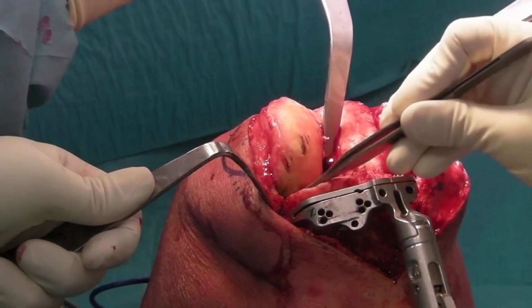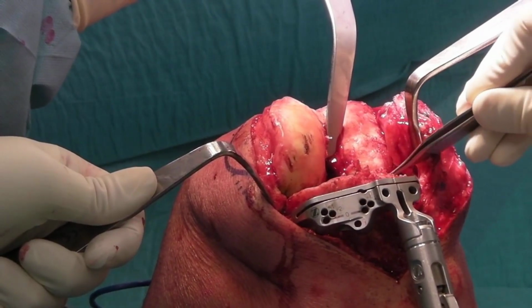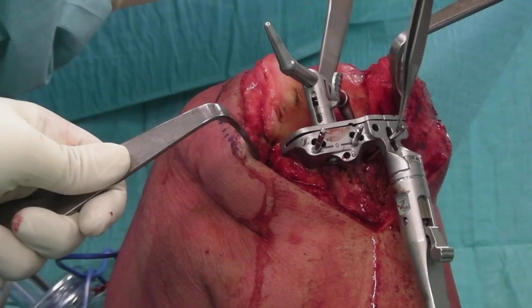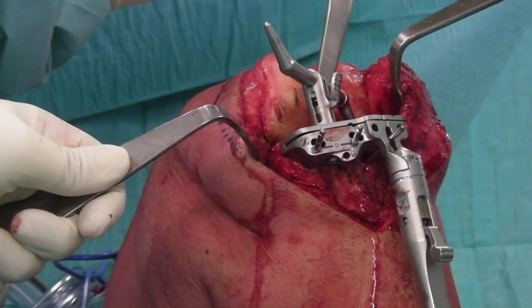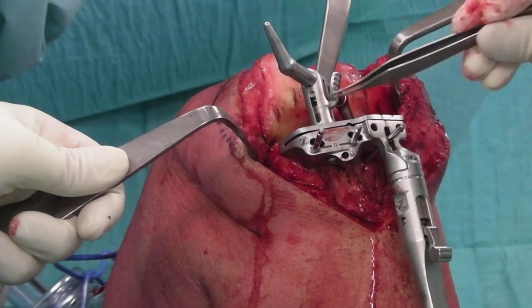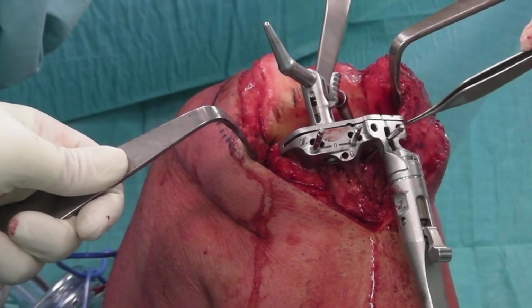Now we can start using the instruments that will help us make the bone cuts, which must be precise and perfectly flat. It is thanks to these instruments that we can plan the degree of correction we want to give to the knee axis.